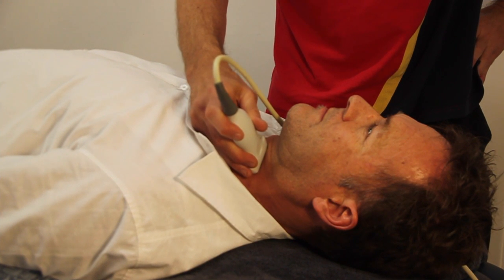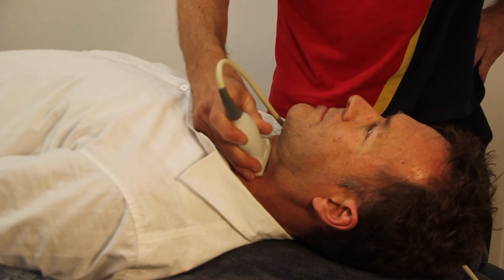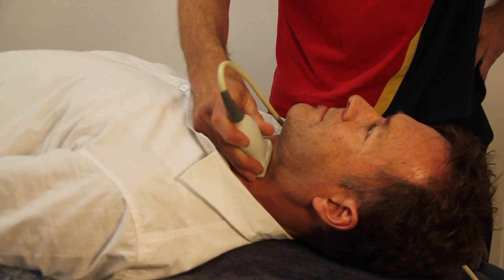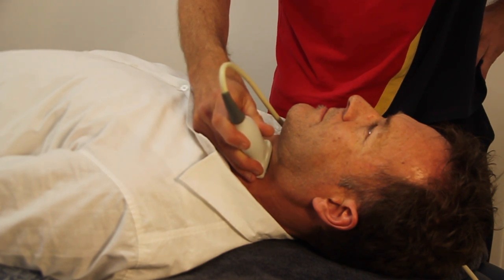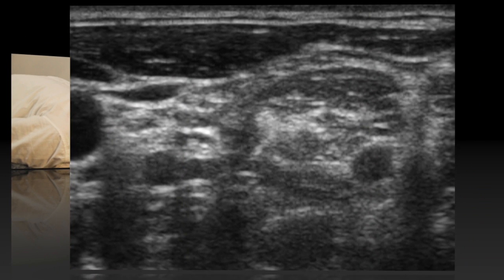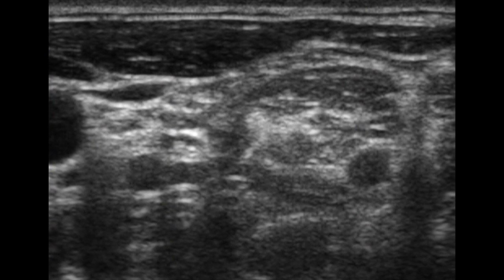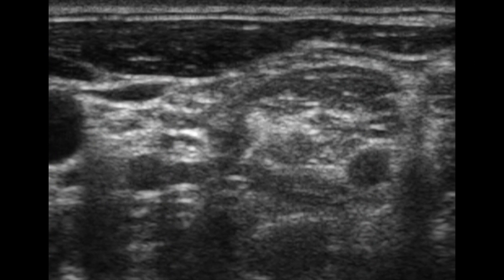The anterior scalene muscle can be scanned in cross section just lateral to the carotid artery. The anterior scalene is seen underneath the sternocleidomastoid and lateral to the longus colli muscle.